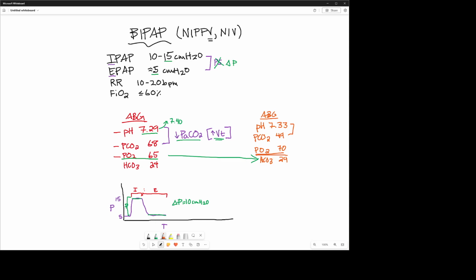All right, one way we can do this is increasing the FiO2, and let's say that we've already gone past the 60%. We're at 75 or 80%, and they're still mildly hypoxemic. Maybe their SATs are cruising around 90, but doc says, hey, let's try to get this PO2 up and the SATs up a little bit, closer to 92. Okay, what can we recommend now? Rather than just throwing more oxygen molecules at them, this isn't quite as effective. We can tell if we get above 60%, they're still hypoxemic. We need to change the dynamic of how the airflow is going into and out of the lungs.